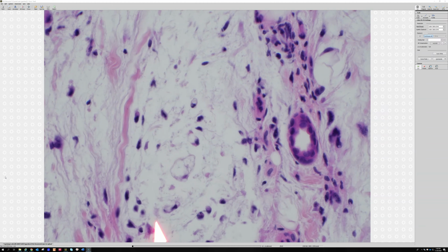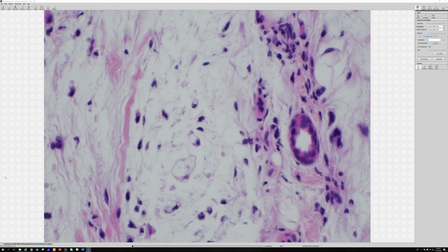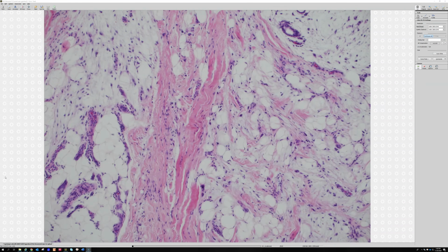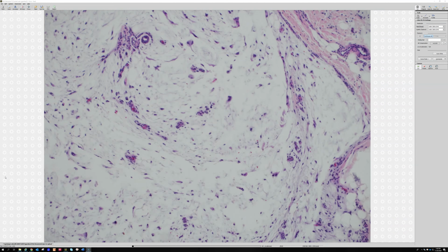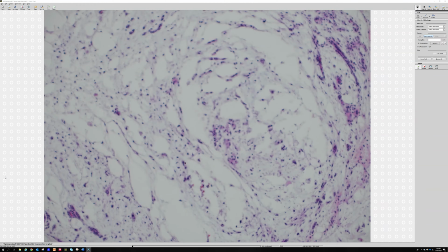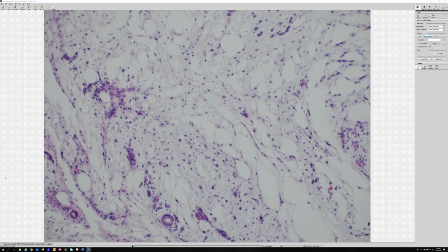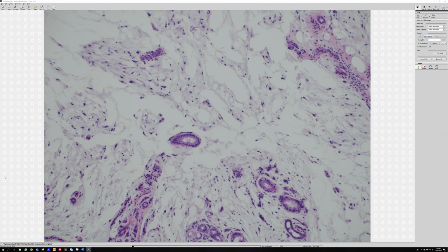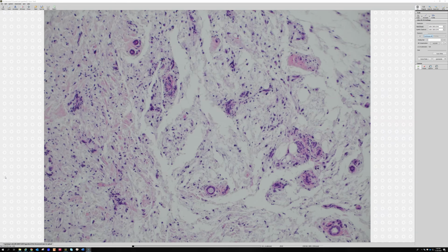Here's another one down here. And this is a common thing. You can see it in other sarcomas with myxoid change, but it's particularly characteristic of myxofibrosarcoma. And I think I even saw, if I recall over here earlier, a better one, and then I got distracted talking about vessels or something and forgot to point it out. Well, that one was good enough.